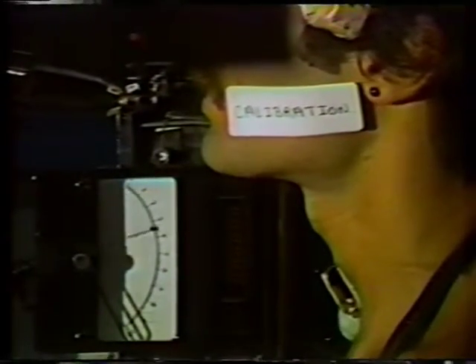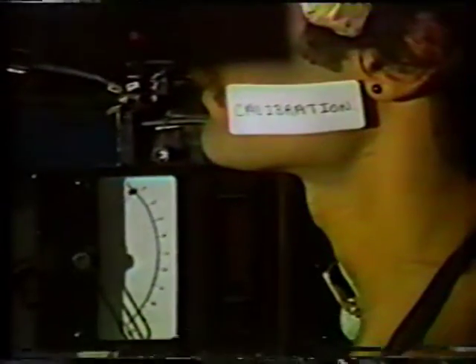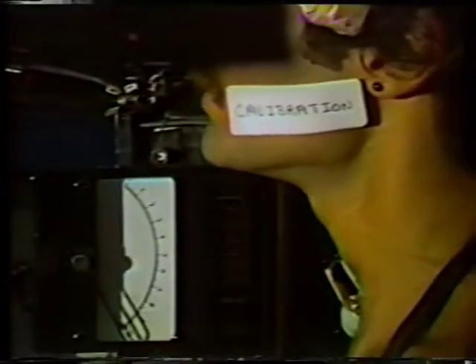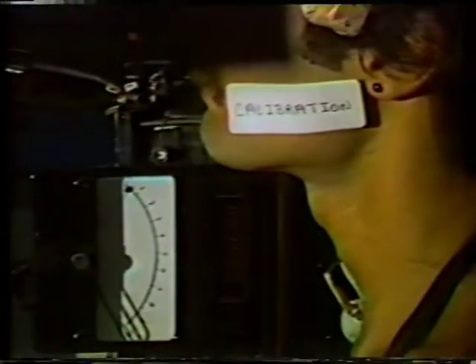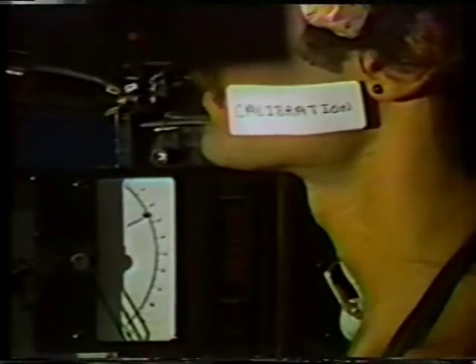Since the magnitude of the EMG signal is dependent upon the distance between the bipolar electrodes, the amount of electrode tip exposure, and the electrode's location within the muscle, it is impossible to compare obtained muscle contraction magnitudes across subjects, or even from the same subject for two different electrode insertions. To overcome this problem, we have devised a method of physiological calibration.